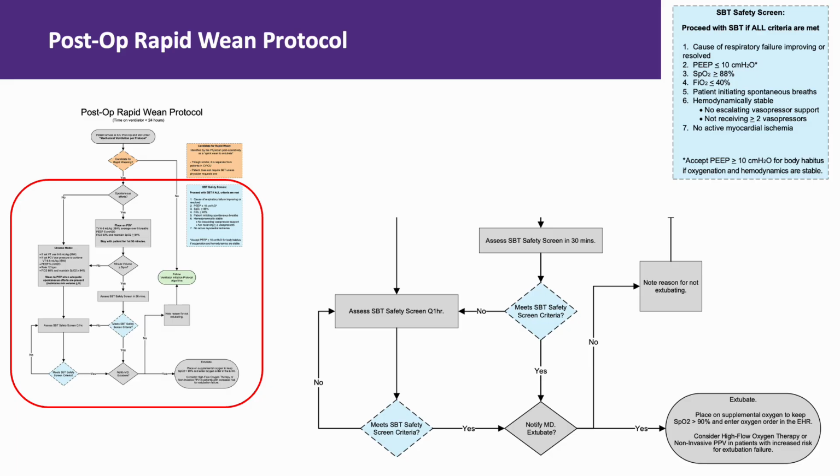Alright, these are the final steps of the post-op rapid wean protocol. This is where we decide whether we liberate the patient or recognize they need more time. Look at the flow chart. If the patient does not meet the criteria at the initial assessment in the algorithm, it's pretty straightforward. Reassess every hour until extubated.